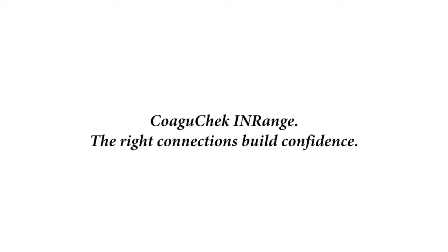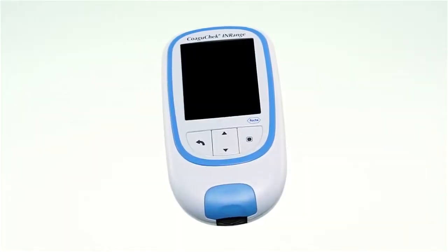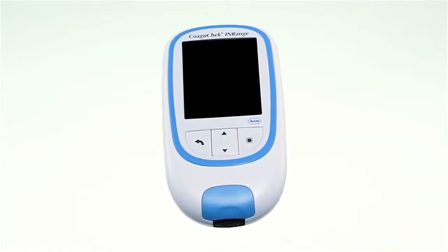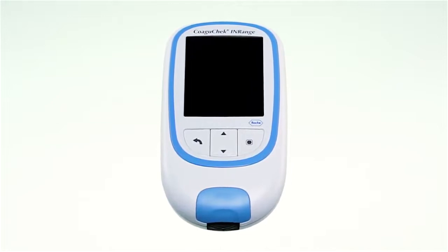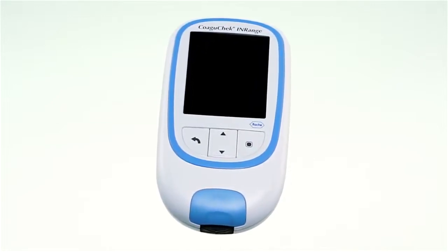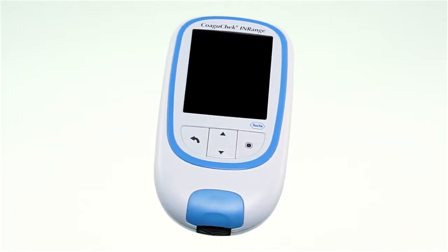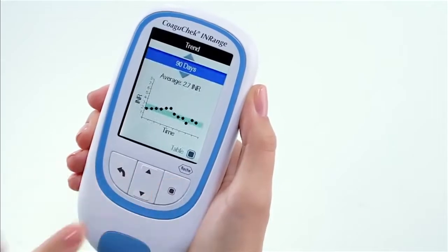COAGUCHECK INRANGE: The right connections build confidence. The COAGUCHECK INRANGE system was specifically designed to give you the confidence to self-monitor your INR and stay in range. This video will walk you through what you need to know to test your INR value.